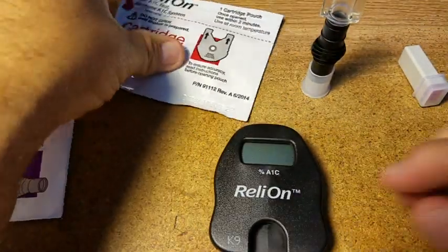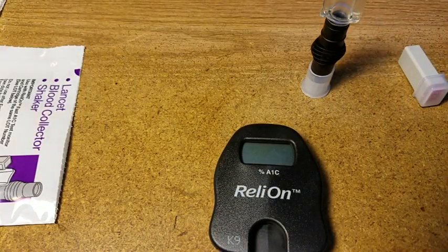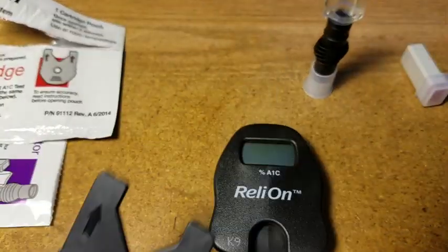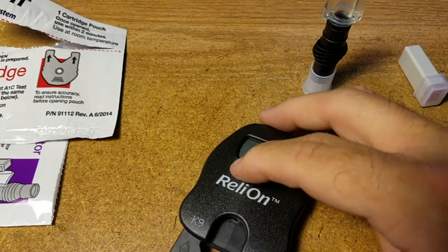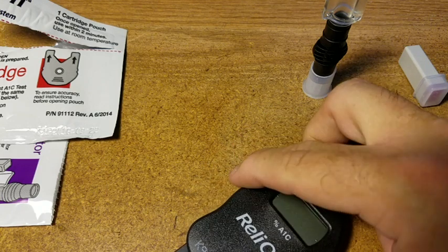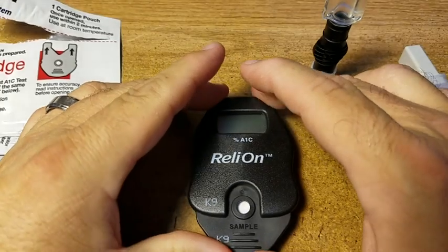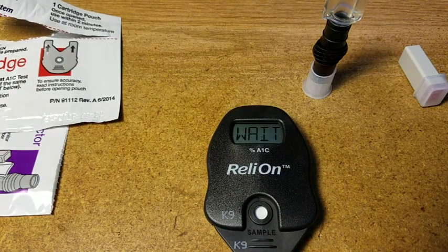Now we're going to take our cartridge and check the lot numbers — everything's good. We're going to open this and make sure it has the same number on the side: K9, K9. And we're going to push it in and wait for it to say 'sample' on the display. It's going to click — there we go, it says 'wait.'